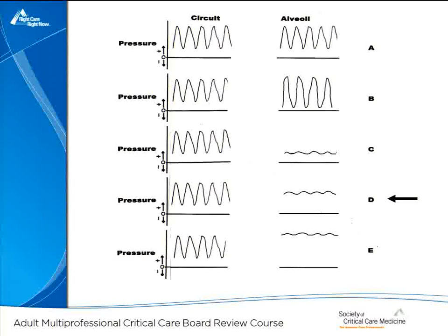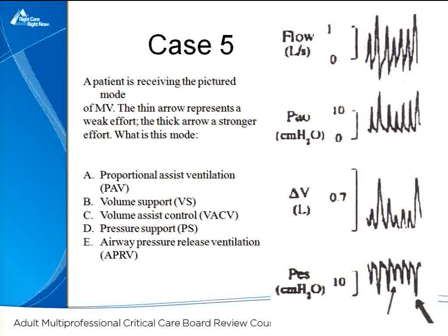Yes, there are circumstances with various harmonics that come up that might alter that, but for the most part, mean pressure in the alveolus is equal to mean pressure in the circuit, but it's just considerably dampened, and as I say, looks like a wiggling CPAP.